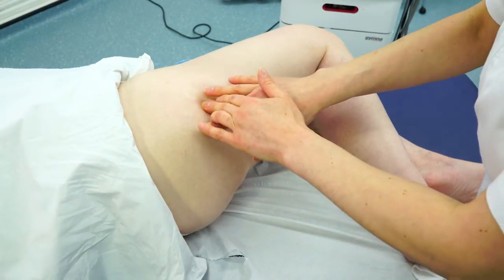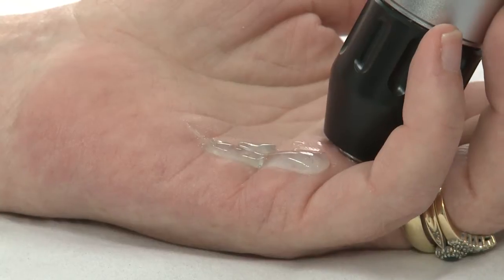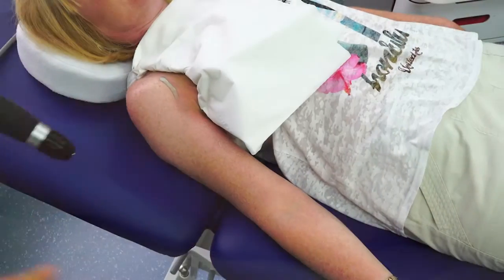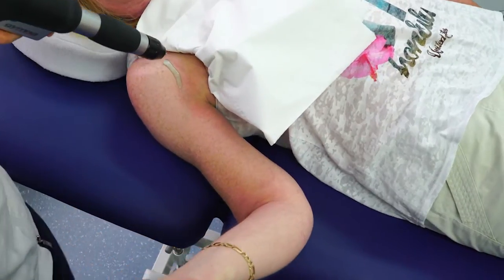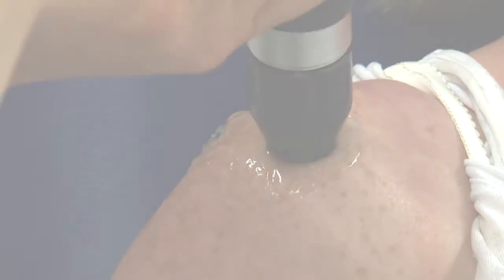A consultation takes place before treatment to determine the type and severity of condition or injury. A course of Extracorporeal Shockwave Therapy usually involves 3 to 6 sessions, each session taking about 15 minutes. Treatment sessions can be spaced 5 to 7 days apart but may differ depending on the patient's progress. Following the treatment, in most cases pain levels should reduce and symptoms should abate after 2 to 3 months following the last session.